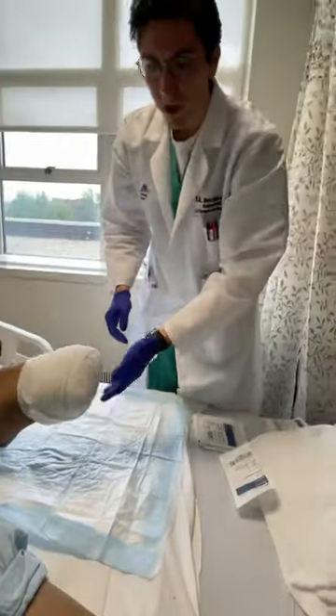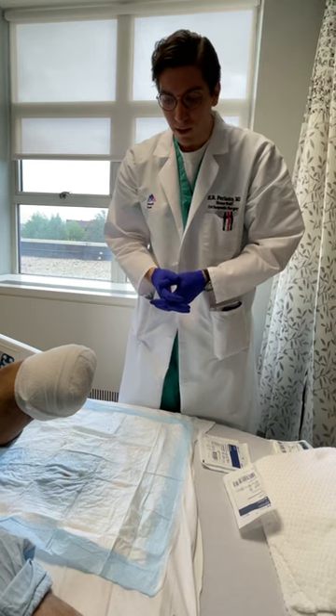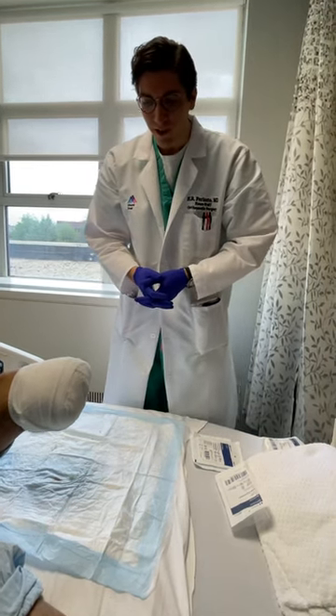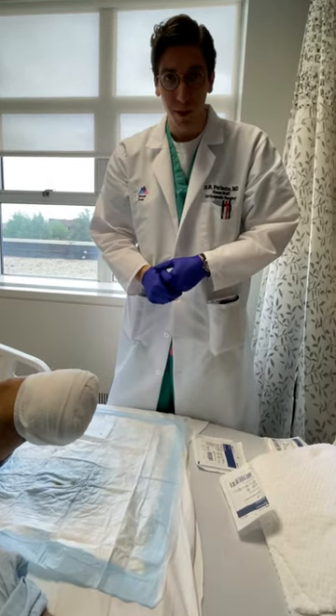And that's how to properly dress a stump. I'd like to thank Dr. Kamineni for showing me this technique, and I hope you all apply it to all your patients for proper hemostasis and proper wound care. Thank you.